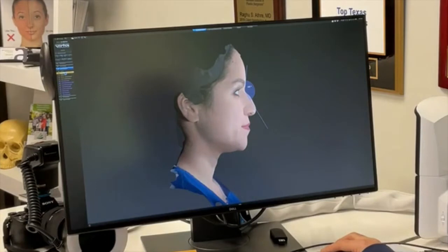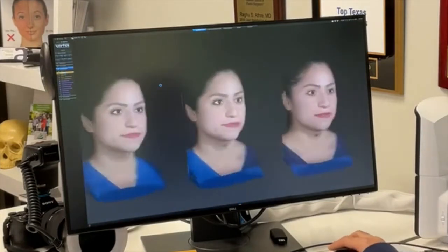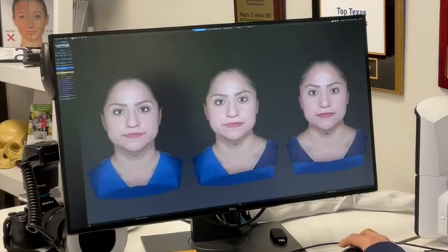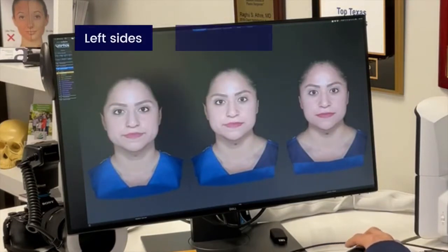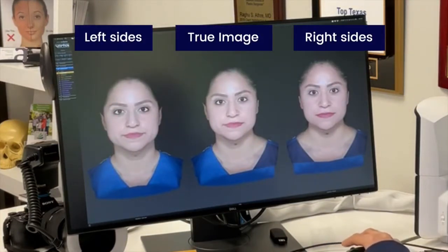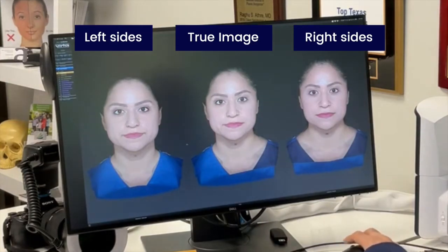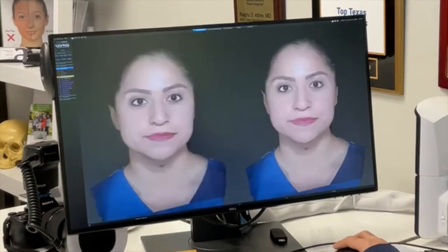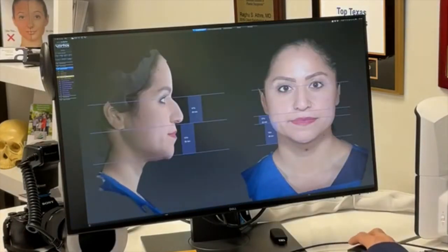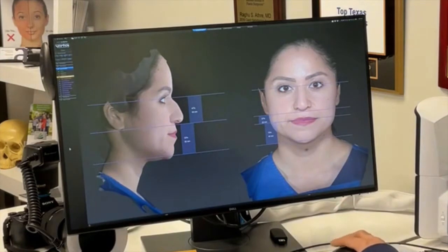The software also gives you information on the 3D model such as the symmetry of the face. You can see three models: the two left halves of the face pasted together, the true image, and the two right halves pasted together. It also gives us the proportionality of the face — objective metrics we use when doing a rhinoplasty.